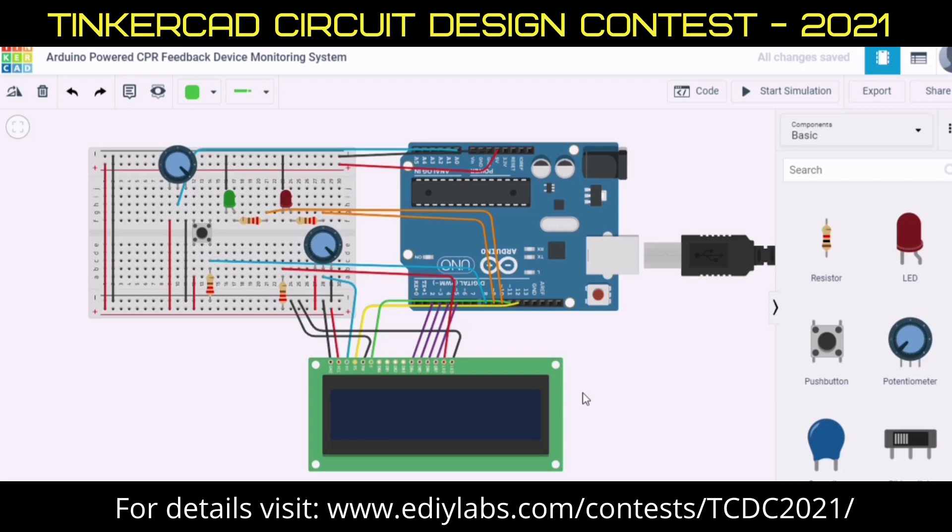The brain of the project is an Arduino. When the chest is pushed to the correct depth required, the push button is activated and the LED turns green. On the other hand, if the correct depth is not reached, the LED turns red instead. Here I show you a simulation process of this project.